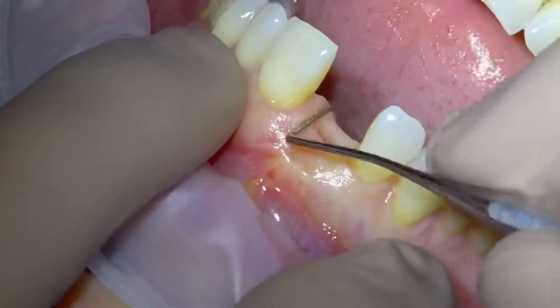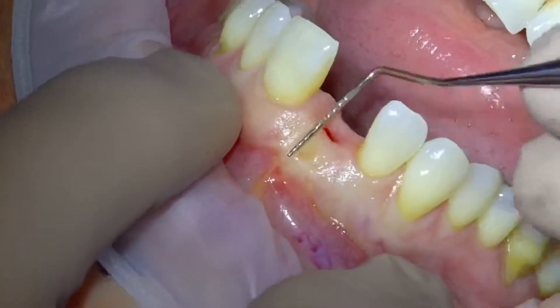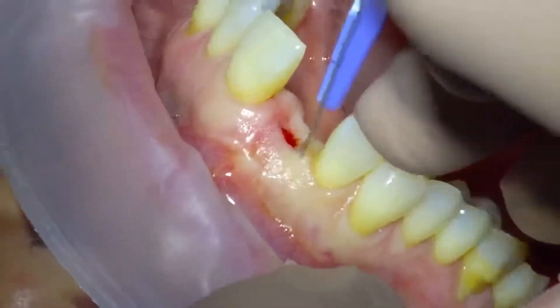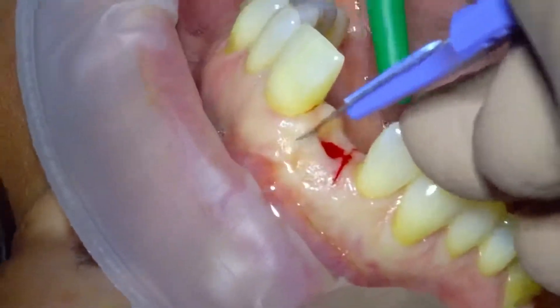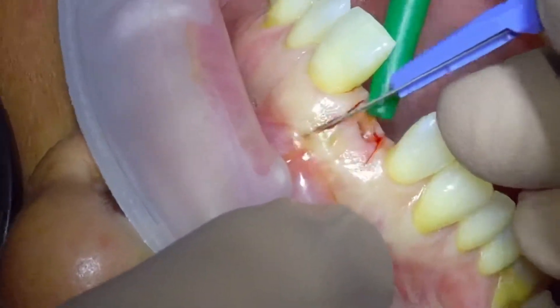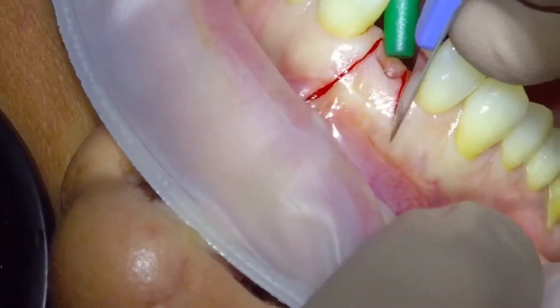Here we can see where the denture was. This is a delayed immediate implant placement protocol, approximately six to eight weeks after extraction. I'm just going to do a little papilla-sparing incision to try and minimise the loss of the papilla that we already see due to the denture and the extraction of the palatal tooth.